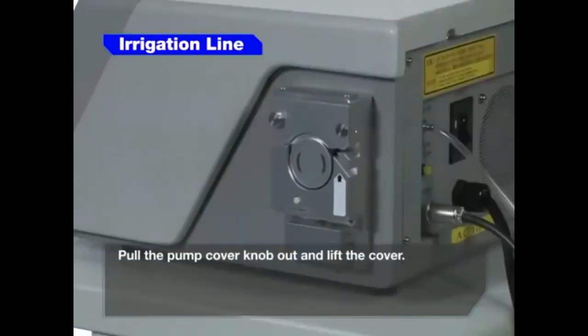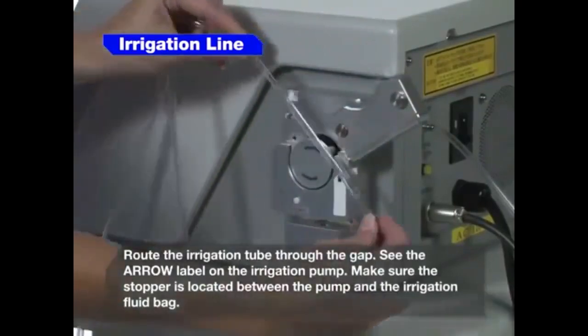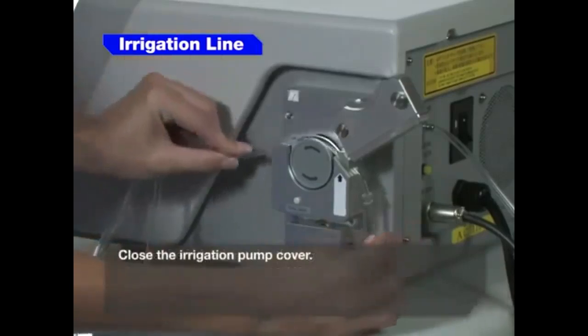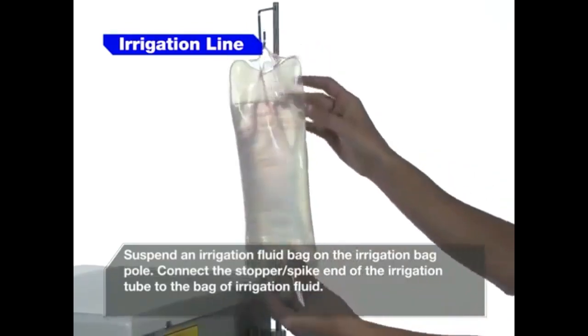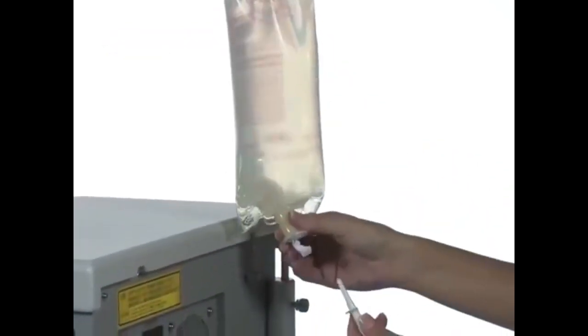Pull the pump cover knob out and lift cover. Route the irrigation tube through the gap. See the arrow labeled on the irrigation pump. Make sure the stopper is located between the pump and the irrigation fluid bag. Close the irrigation pump cover. Suspend an irrigation fluid bag on the irrigation bag pole. Connect the stopper spike end of the irrigation tube to the bag of irrigation fluid.